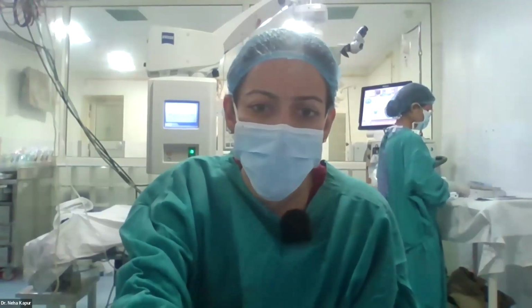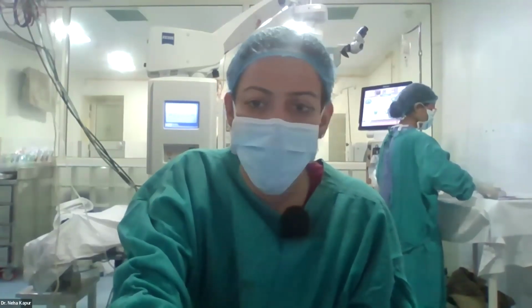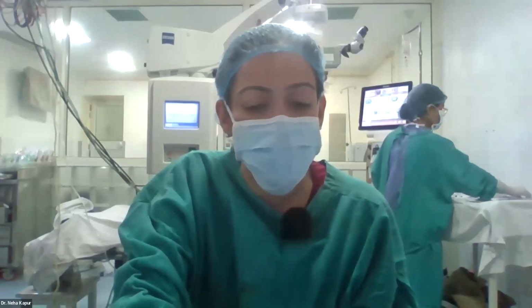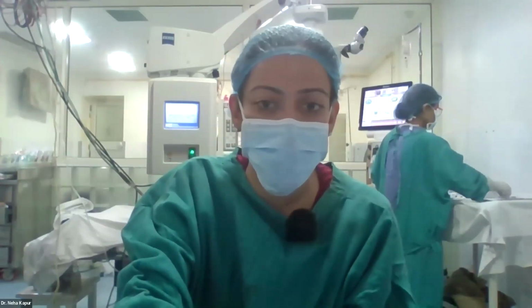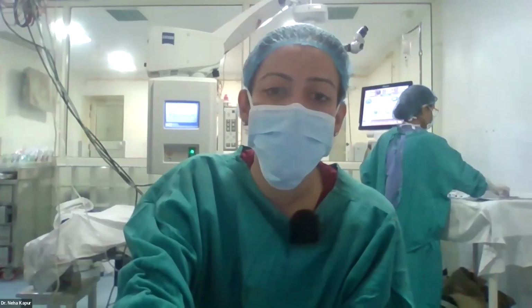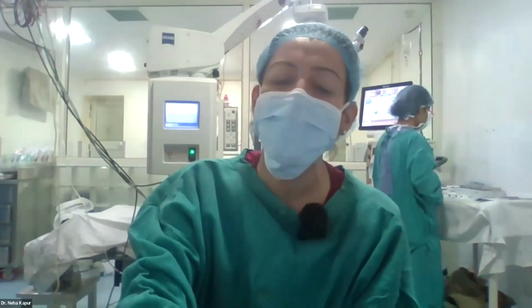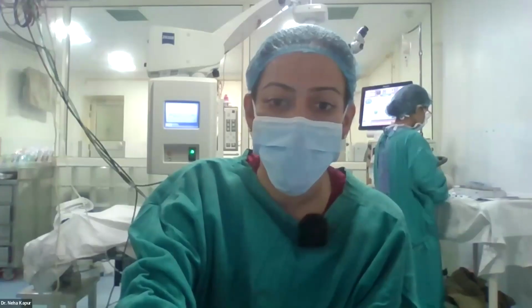Do you do ASOCT routinely to confirm graft attachment? No. If we can clinically tell that the graft is attached, you do not need an ASOCT. So it is not essential to be dependent on an ASOCT. Usually a slit lamp will tell you very well whether the graft is attached or not.